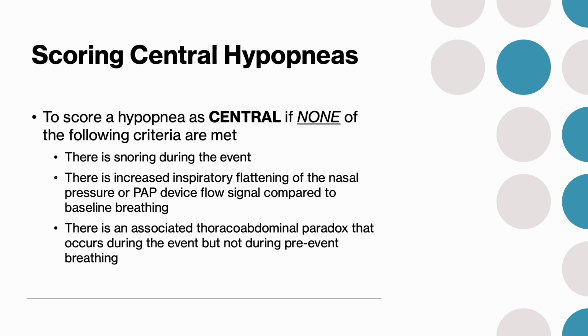Sometimes patients on oxygen might have hypopneas but not the desaturation, because supplemental oxygen might blunt the desaturation. There are currently no scoring guidelines for when a patient is on oxygen and no desaturation is noted. If the diagnostic study is performed while the individual is on supplemental oxygen, its presence should be documented in the notes.